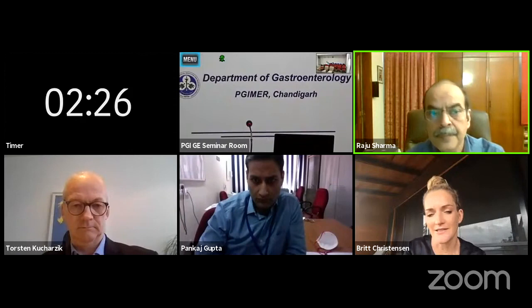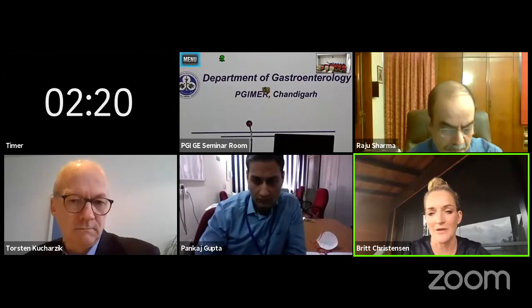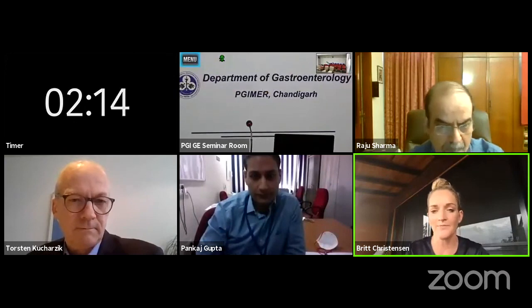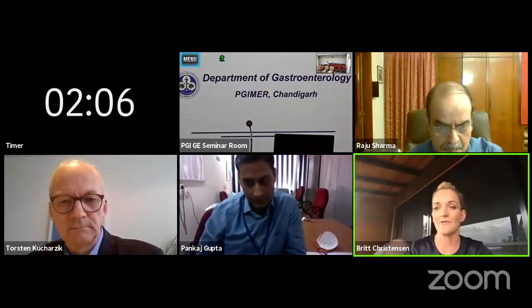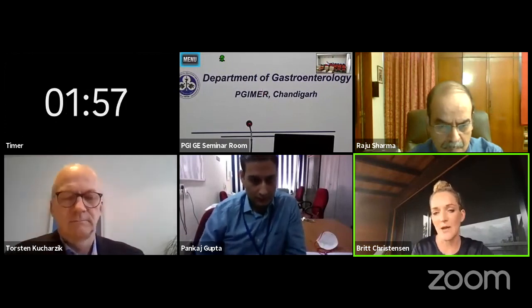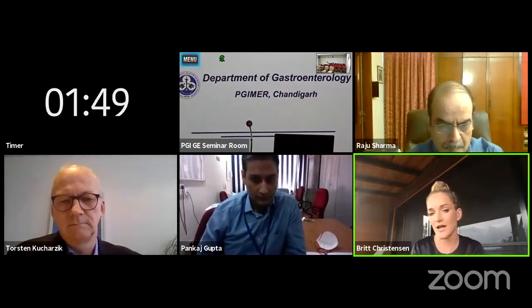Awesome. I'll just add to that, I totally agree with what Torsten said, but it's sort of adding another tool to our armamentarium on how we can monitor the disease. If I have a new diagnosis patient, I will still do my MRE and then I'll make sure my ultrasound aligns, and then I can discard the MRI. I don't need to keep doing them every time I see the patient or every year, unless it doesn't make sense. If eventually they're showing symptoms or something's going on, and I think this is not fitting with the ultrasound, I may then go, okay, maybe I need an MRI again in that situation. But that yearly MRE to follow the patient, you don't need to do anymore, because if that first MRI and ultrasound align, the ultrasound is perfect to monitor those patients.